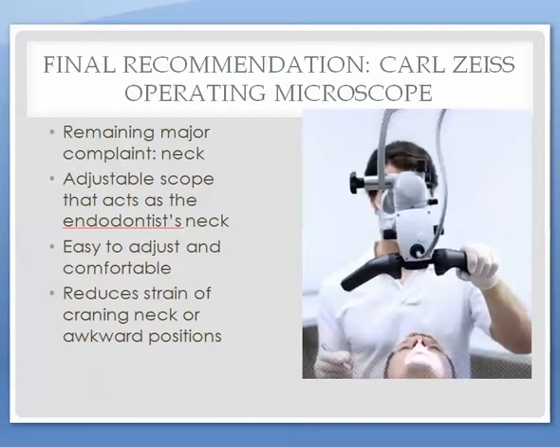While loupes were a good intermediate solution for the aforementioned gaps, based on my literature review, the Carl Zeiss operating microscope seems to be the best recommendation for endodontists. As we saw, it will address the back concern, but it also addresses the other major concern, which is pain in the neck. The ability to adjust the scope, as seen in the picture, essentially widens the field of view and prevents the need to crane or awkwardly position one's neck.